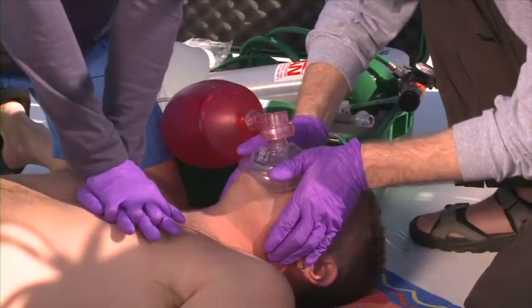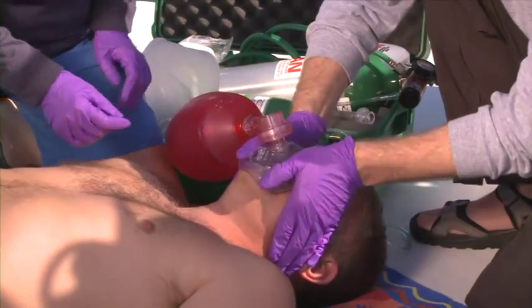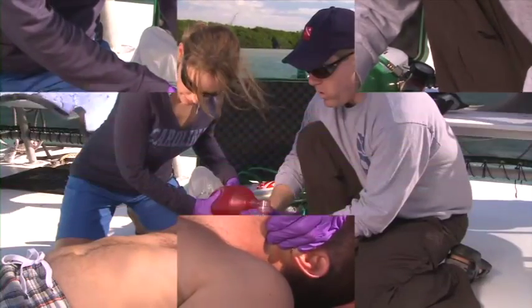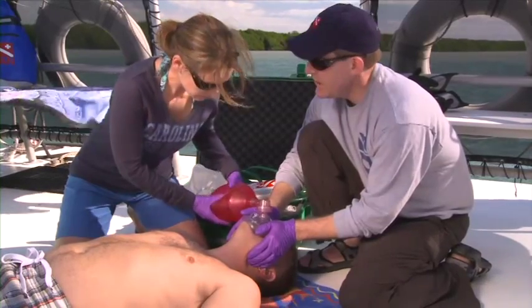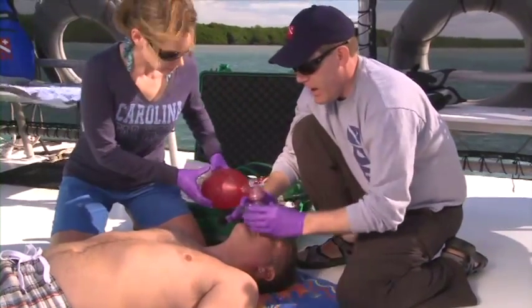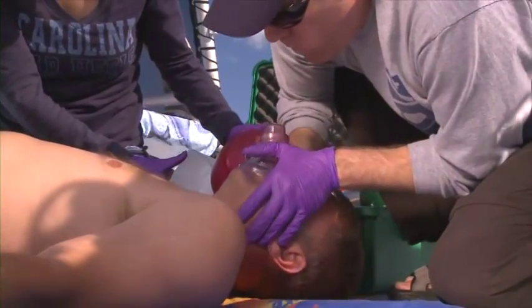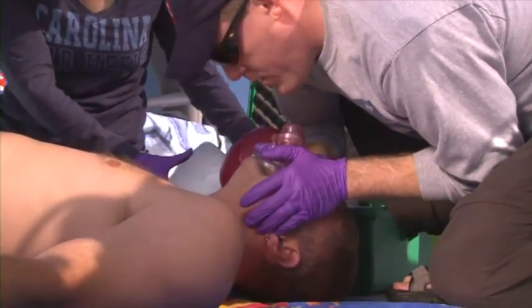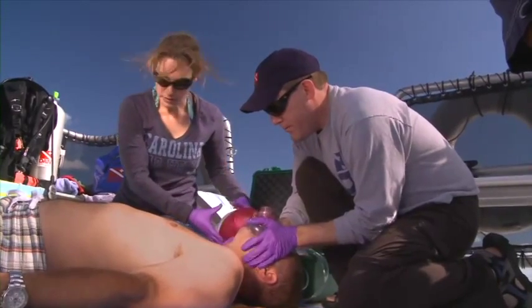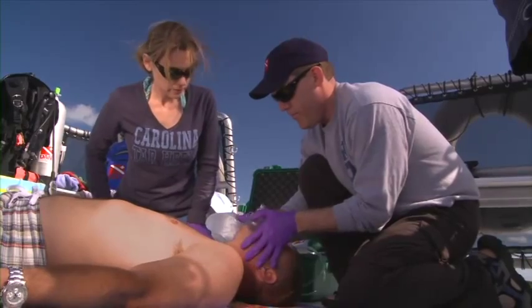If a patient's chest does not rise when ventilated with a BVM, first reposition the head and attempt another ventilation. If unsuccessful, check for any obstructions such as fluids or solids in the mouth. Remember, the most common obstruction is the patient's own tongue. Look and listen for a poor seal between the mask and the patient's face and reposition your hands and fingers as necessary. If you cannot effectively provide ventilations using a BVM, consider performing mouth-to-mask ventilations using a resuscitation mask as an alternative.